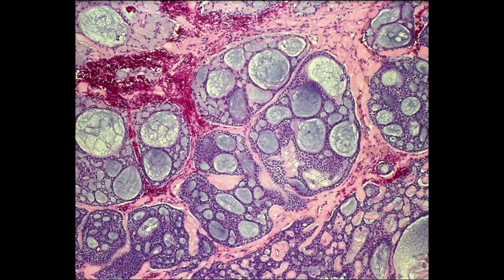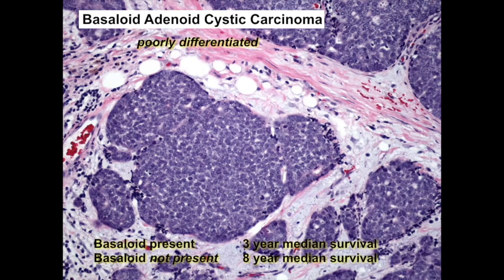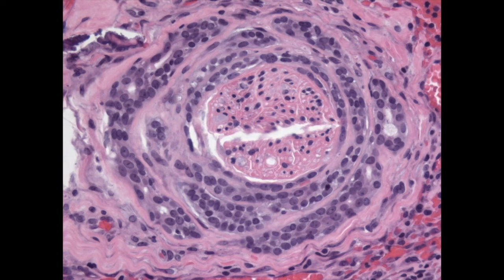Now here's the classic cribriform or Swiss cheese pattern of adenoid cystic carcinoma. This is just one of the growth patterns, but it's a very characteristic pattern that they frequently show on histologic examinations. This is a poorly differentiated form of adenoid cystic carcinoma, the basaloid variant. Patients whose tumors have a basaloid component have a poorer prognosis. Adenoid cystic carcinoma typically is painful due to perineural invasion, shown here in this photomicrograph.